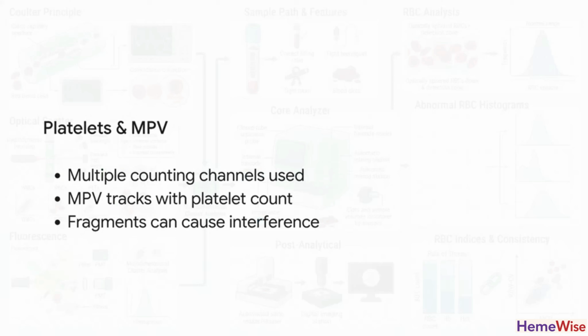Now, platelets. Believe it or not, these guys can be surprisingly tricky to count accurately. Because they're just so tiny, severely microcytic red blood cells or cell fragments can easily crash the party and impersonate them during a standard impedance count. That is exactly why we often bring in optical scatter, dedicated fluorescence channels, or even high-end flow cytometry to clear through the noise and find the true platelets.